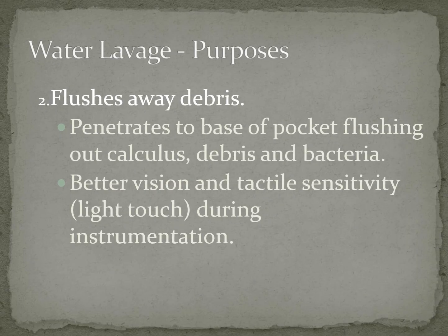Another purpose is it's going to flush that debris away. So it's going to go down to the base of that pocket. It's going to flush out that calculus. It's going to flush out that debris. It's going to destroy all of that bacteria. Okay. It's going to be much better for our vision.